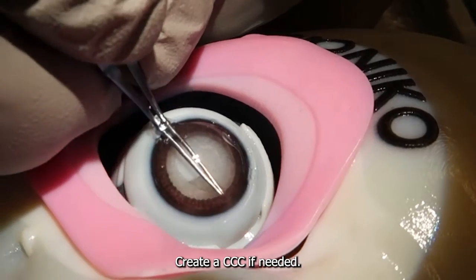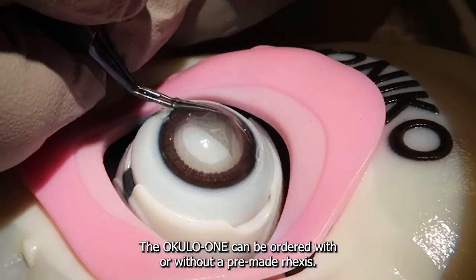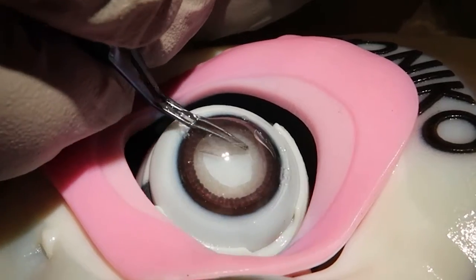Create a CCC if needed. The OKULO-ONE can be ordered with or without a pre-made rhexis.